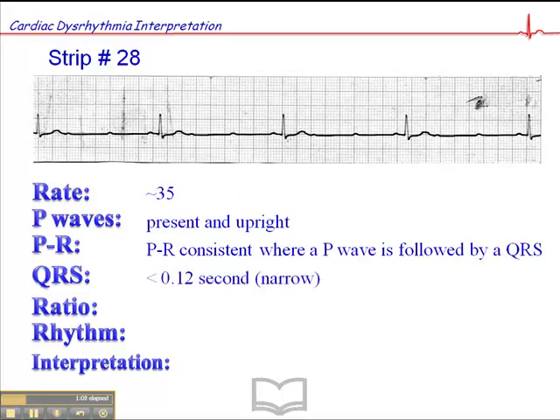The QRS is narrow, less than 0.12 seconds. The ratio is 3 to 1 — so we have a P wave here, a P wave here, and a third P wave there. And again, we see the pattern repeated: P wave, P wave, P wave.